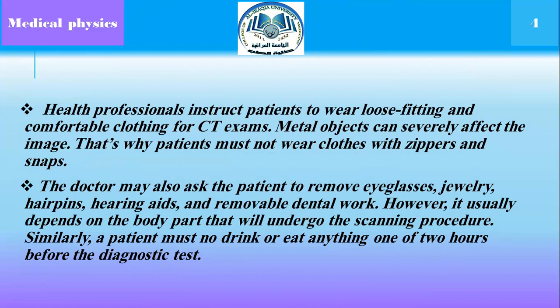The doctor may also ask the patient to remove eyeglasses, jewelry, hairpins, hearing aids, and removable dental work. However, it usually depends on the body part that will be undergo the scanning procedure.